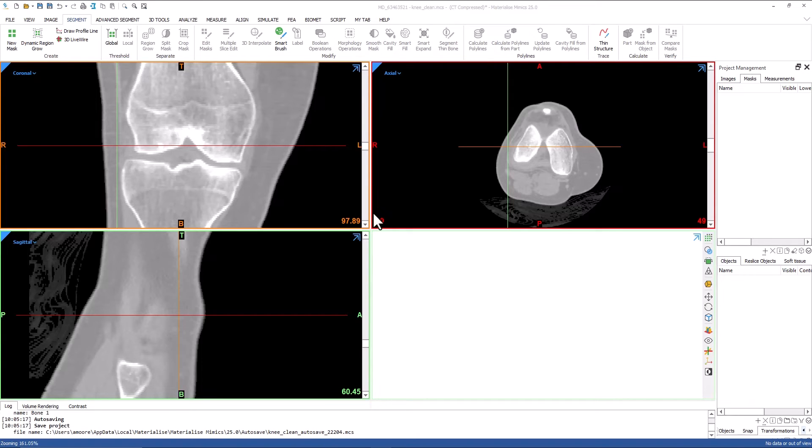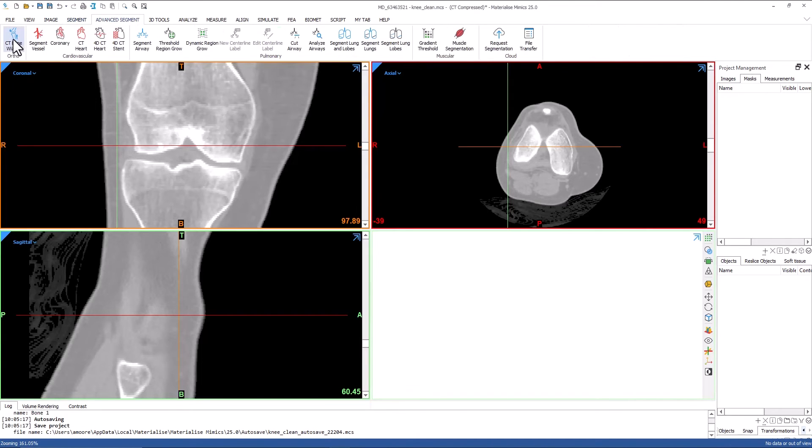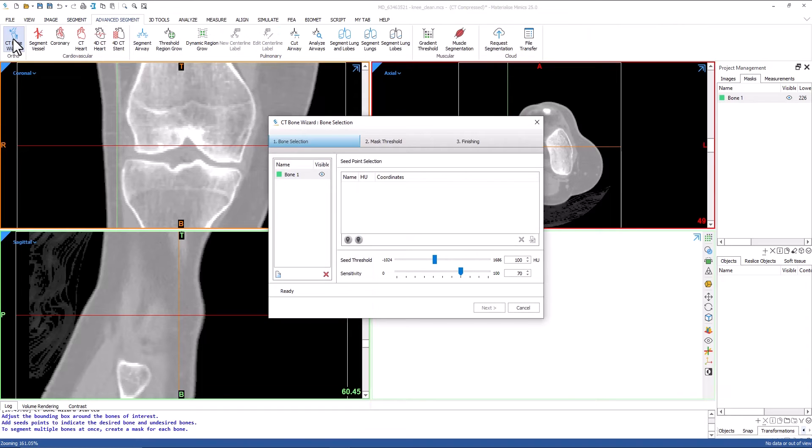Once the images are imported into Mimix, we will open the CT Bone Wizard tool from the advanced segment menu.